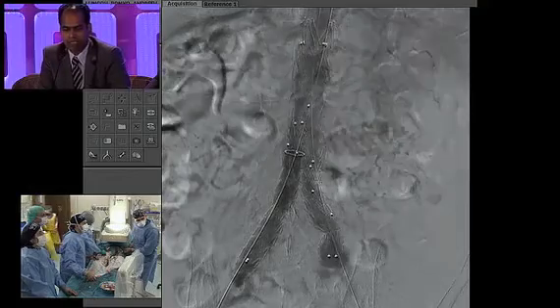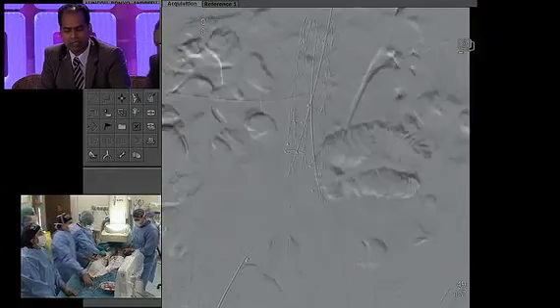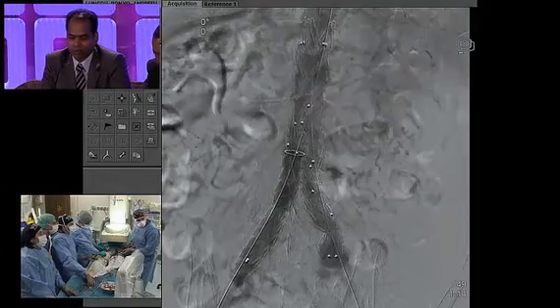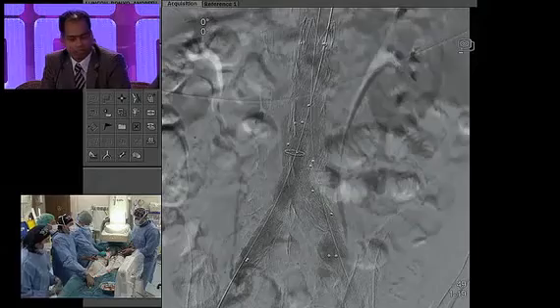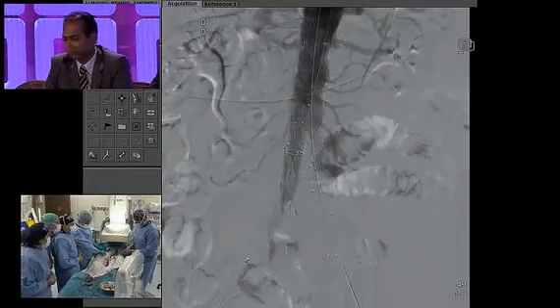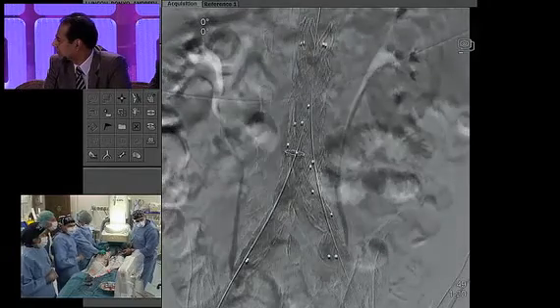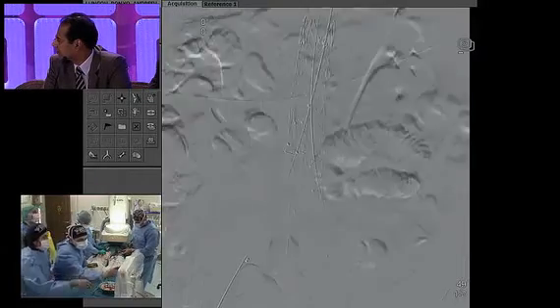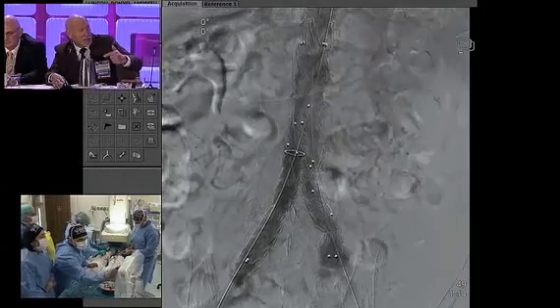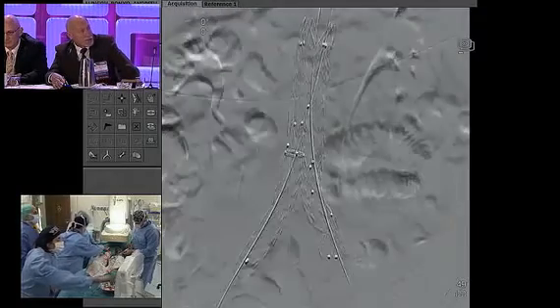I don't know of a technique that would readily allow us on license to preserve that internal iliac now. Improvised techniques are possible, but it's making it unnecessarily difficult for the future. Placing a bifurcated stent graft in the iliac artery from a previous stent graft is very difficult. I don't know how for the contralateral side you can do it. I should not advise this.